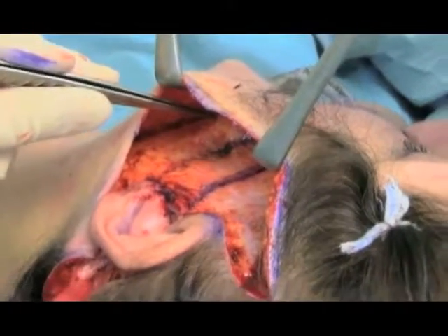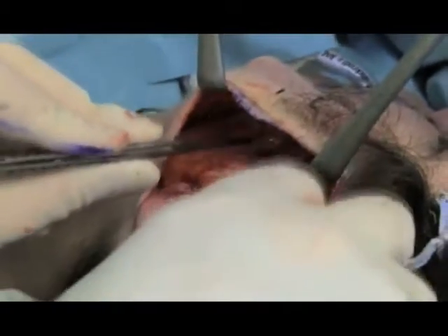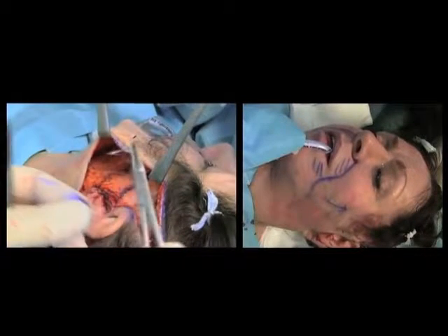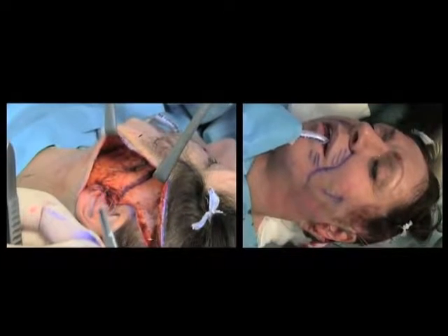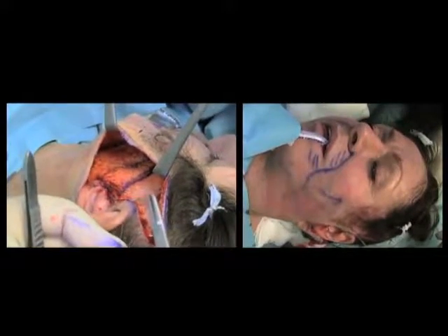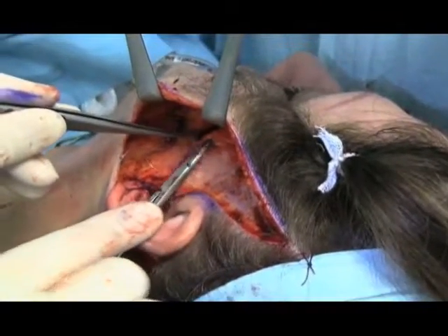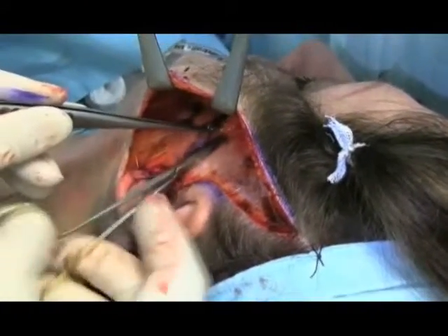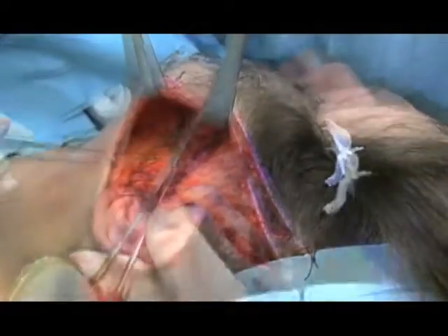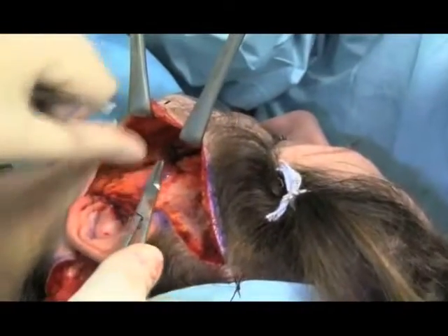A generous bite of SMAS is taken with a 2-0 PDS suture inserted distally. A suitable effect can be confirmed by looking externally. The suture is then tied firmly to the less mobile parotidomasseteric fascia.